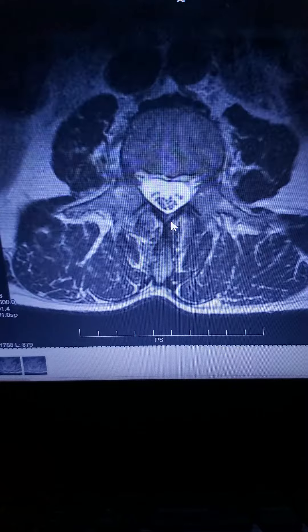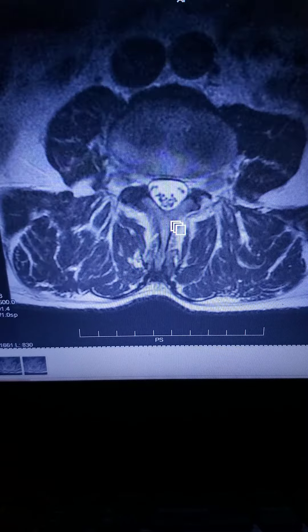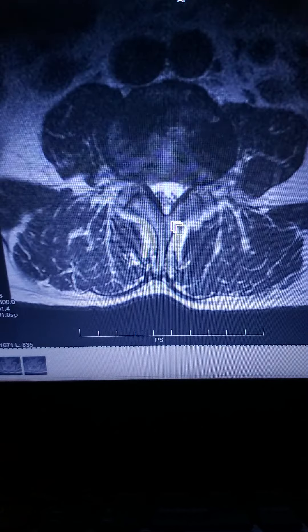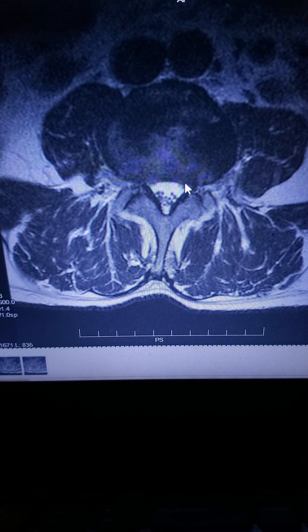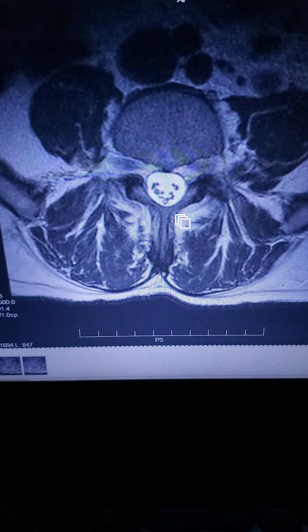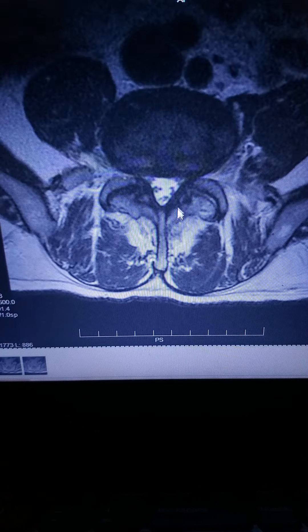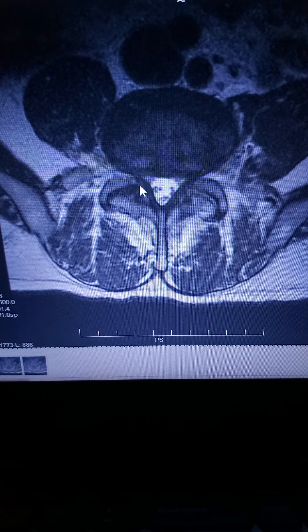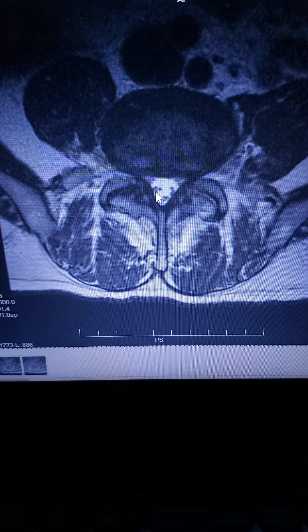Then we go down to L3-4 — we have a little bit more inflammation and disc bulging. And then going down to L4-5, we have a significant amount of inflamed ligaments, disc bulging, and arthritis in the facet joints. It's all squeezing the spine — it's called stenosis.